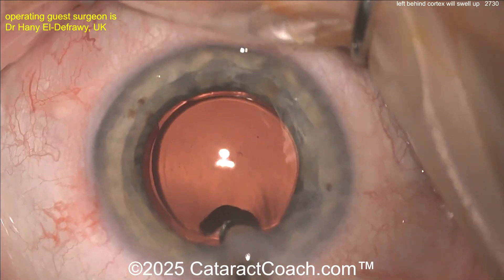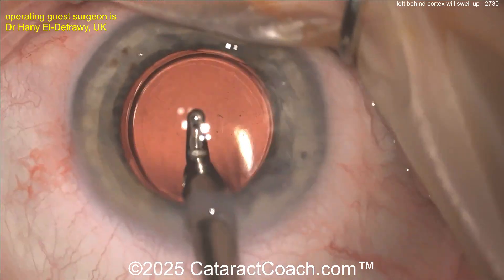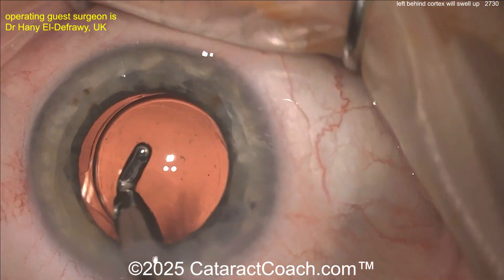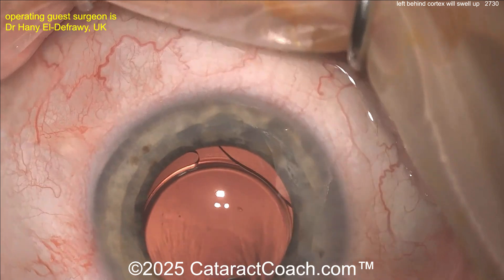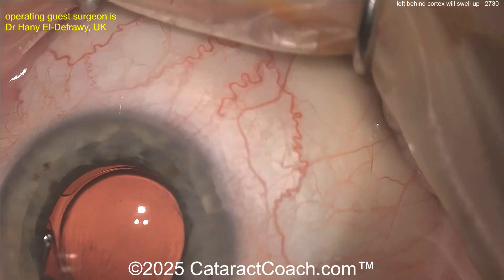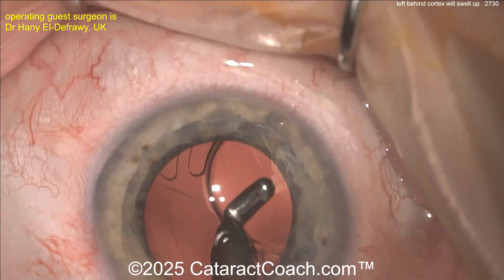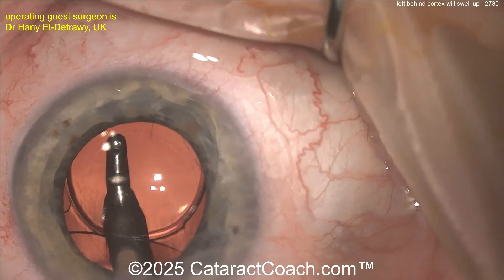In a case like this I may want to put some triamcinolone inside the anterior chamber just to quell the inflammation that's already there. Remember, these lens proteins have not been seen by your immune system generally, and as a result in the post-op period when you leave that lens material there, you get a tremendous inflammatory response. You may have to calm that down with intracameral steroids — I like a little preservative-free triamcinolone, maybe a half milligram to one milligram at most.